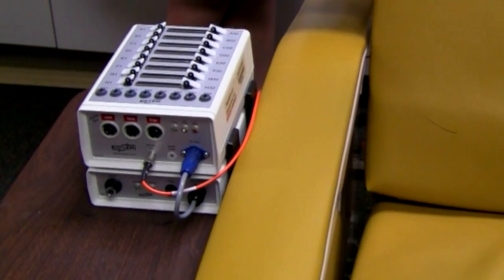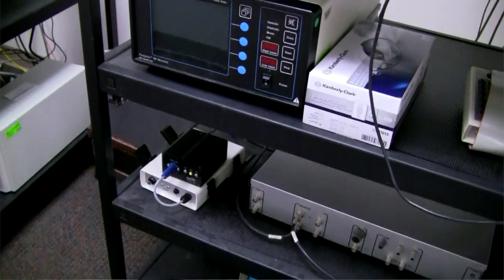Once everything's acceptable and good to go, we'll begin the task, whether it's sit quietly and observe just natural activity or do a cognitive task, and we'll see how your brain responds to different stimuli. The electrodes are plugged into an amplifier that feeds the data acquisition computer.